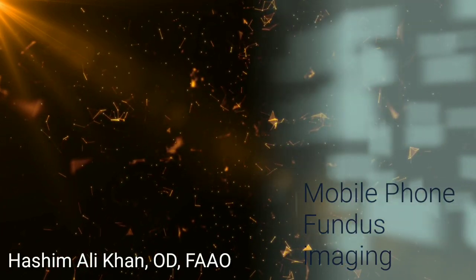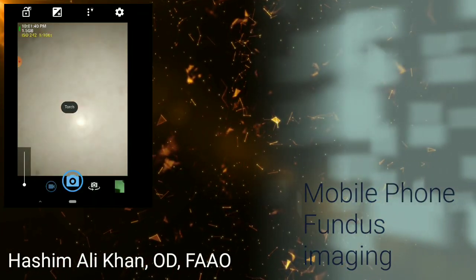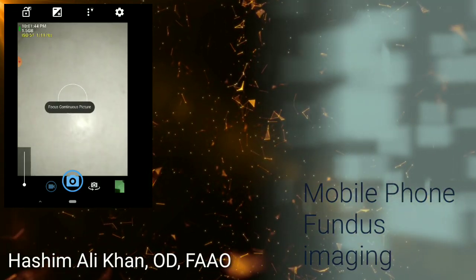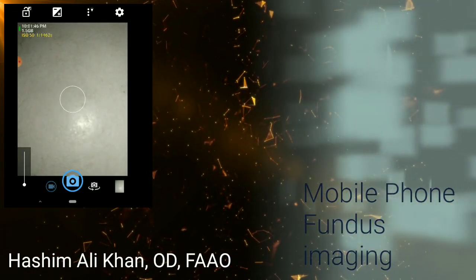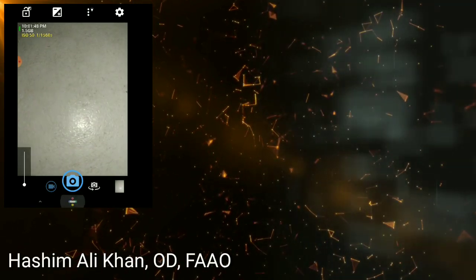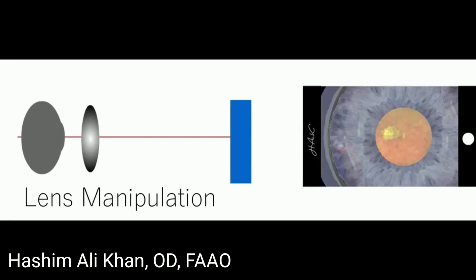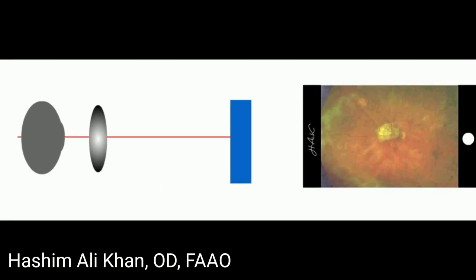set to always on. Now open the camera, set the flash to continuously firing mode, some call it the torch mode. Adjust the exposure because an overexposed image may be washed out and details are not much clear. Introduce the lens close to the eye and hold your phone at arm's distance from the lens. Focus the pupil and iris through your camera app.